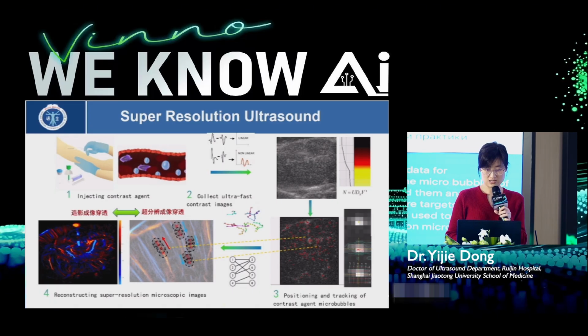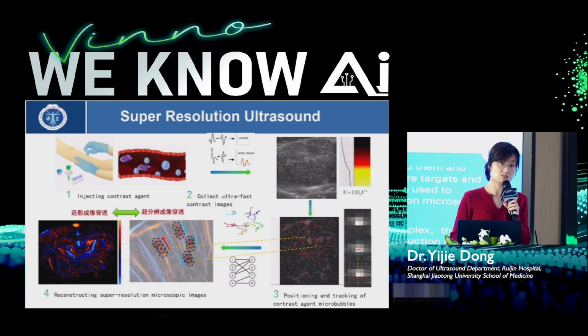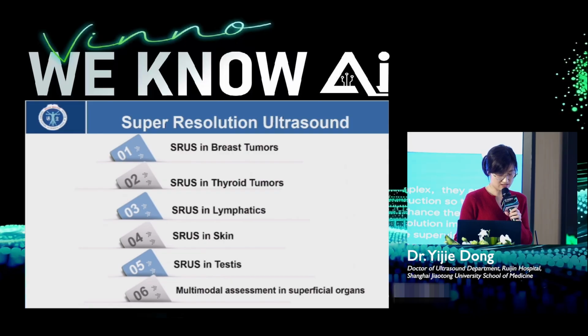Of course, now we not only have superficial probes, but also probes for use in the deep abdomen. We also have this probe. So today, I'd like to share 6 aspects in my presentation.